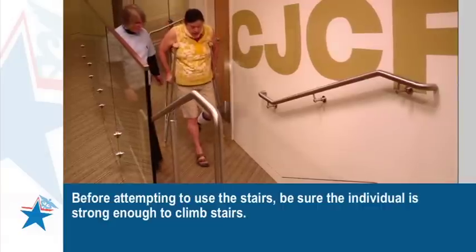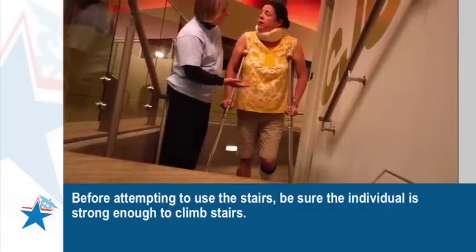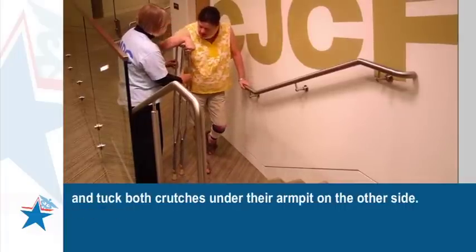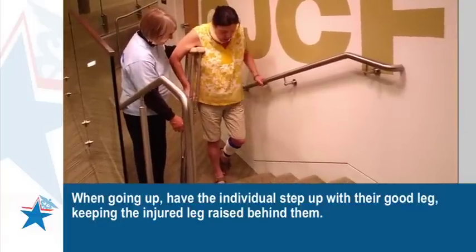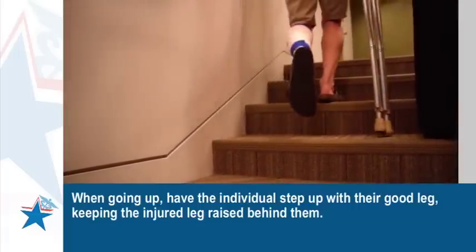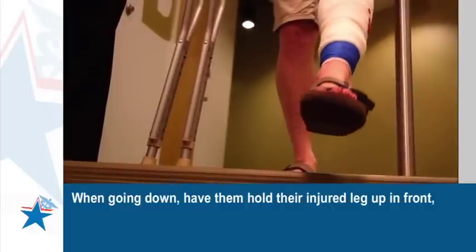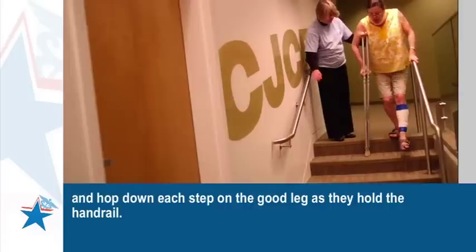Before attempting to use the stairs, be sure the individual is strong enough to climb stairs. Facing the stairs, have the individual hold the handrail with one hand and tuck both crutches under their armpit on the other side. When going up, have the individual step up with their good leg, keeping the injured leg raised behind them. When going down, have them hold their injured leg up in front and hop down each step on the good leg as they hold the handrail.